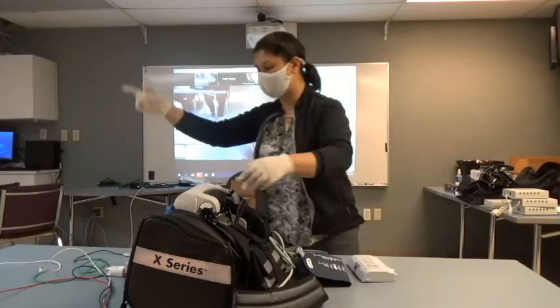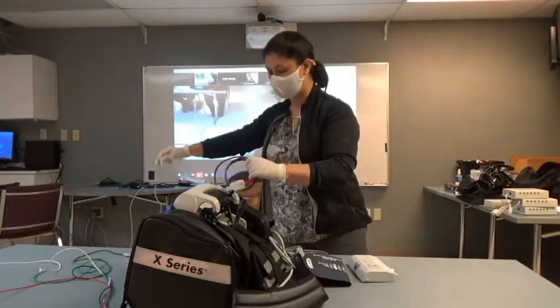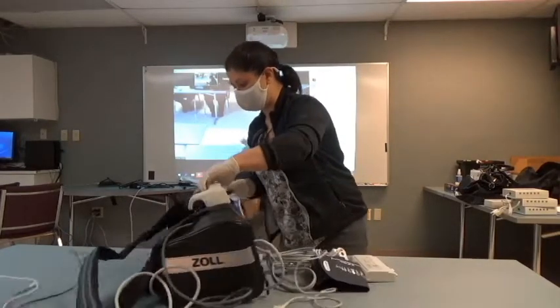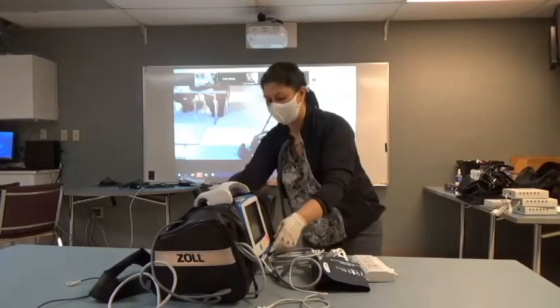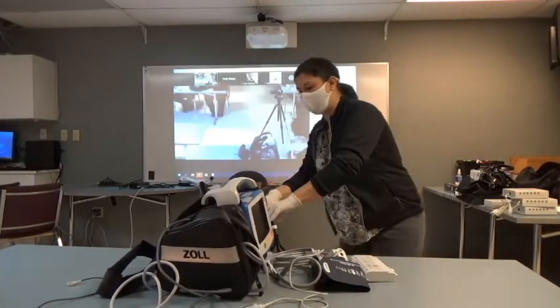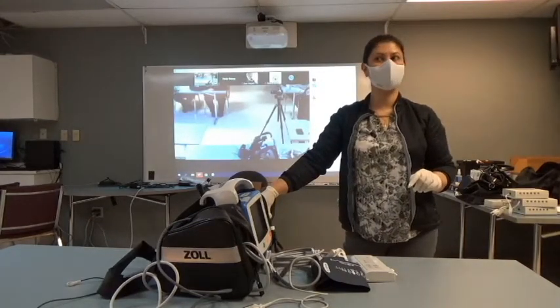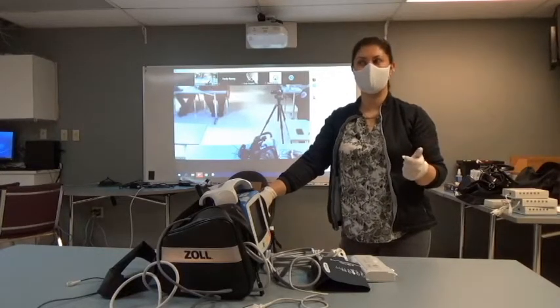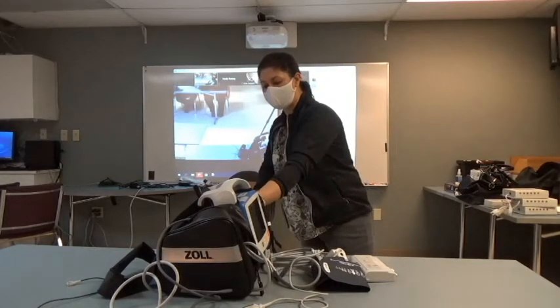Okay, I'm going to switch this around to your critical care side. And in your critical care side, all the way up at the top, there's a little USB connection. This is for software updates. This is to move data. So your MiFis will be connected into there. And then you have your multifunction cable.